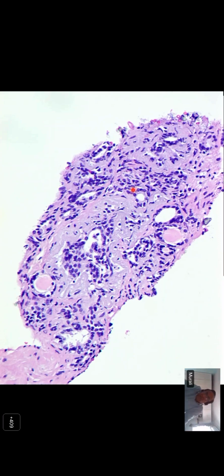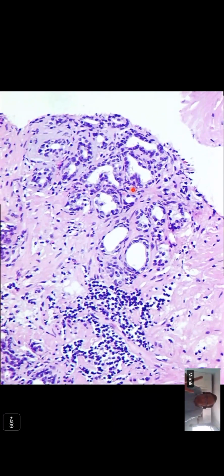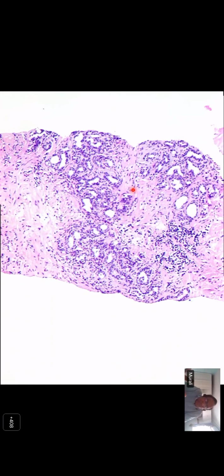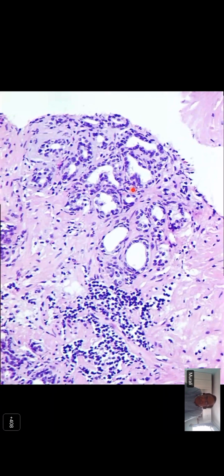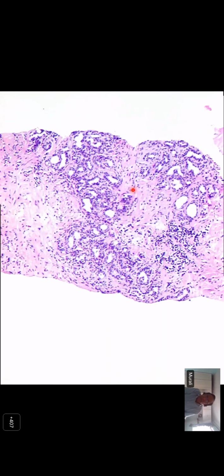Ductal type of adenocarcinoma of the prostate can have a stromal reaction. So in this case, three features really should make you question that this may not be prostate cancer: the atrophic appearance, the desmoplastic or stromal reaction, and the lymphocytic infiltration in the background related to these glands. These three things are unusual in prostate. They can happen. It doesn't exclude prostate cancer, but that's the sort of thing that makes you feel that you would at least want to do immunohistochemistry.